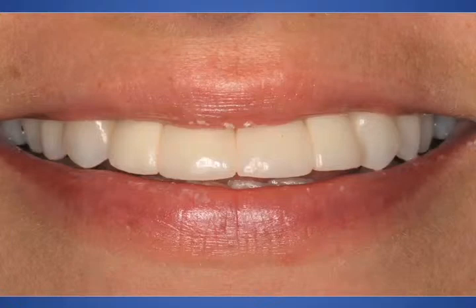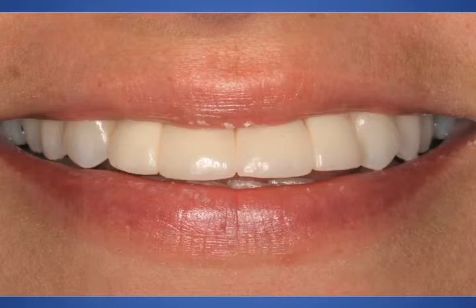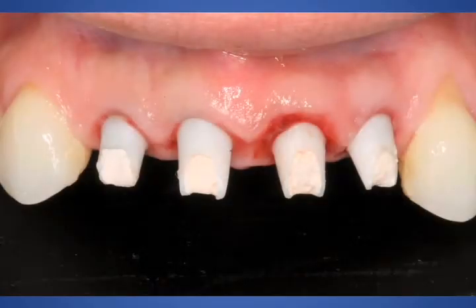Now, after approximately 4 months of integration, we used our standard impression technique to fabricate our final zirconia abutments. So we take a normal impression, and the laboratory will then do their artistry to create 4 single zirconia crowns. Here you can see the zirconia abutments in place. They are torqued into position, and I put a little cavit over those screw holes.